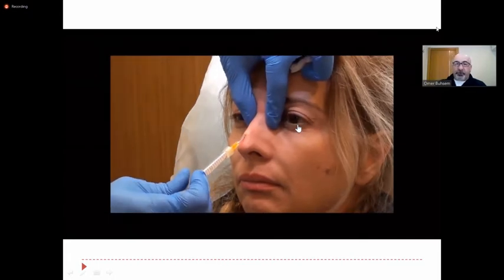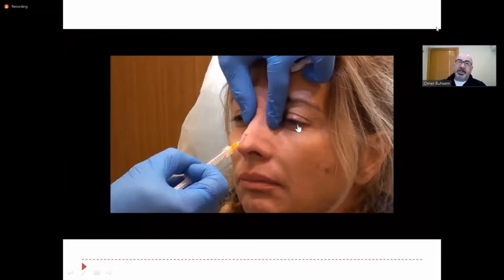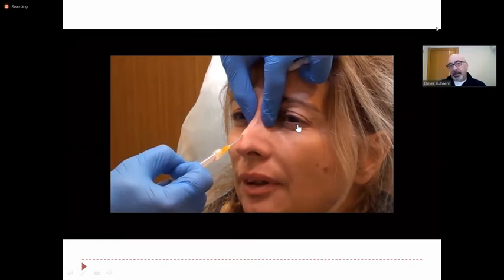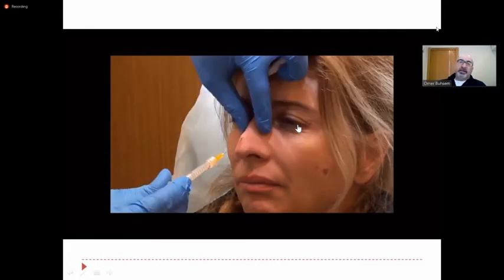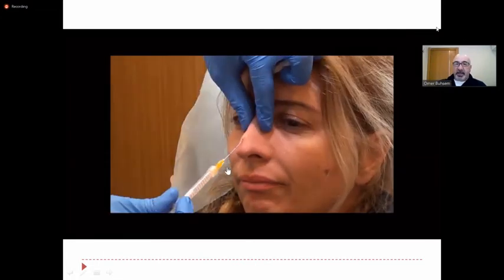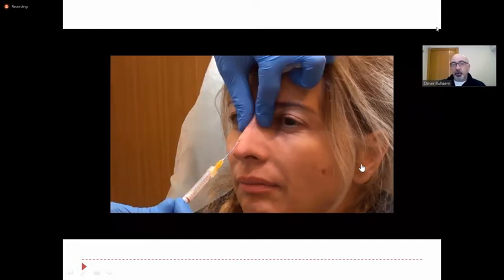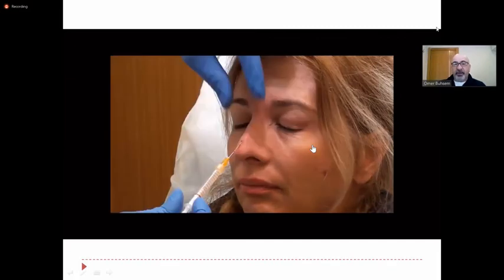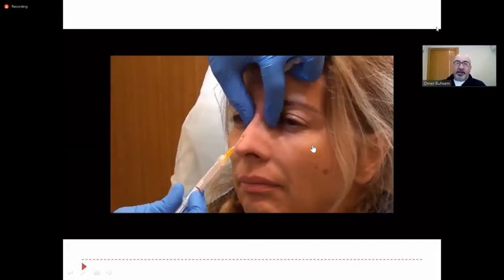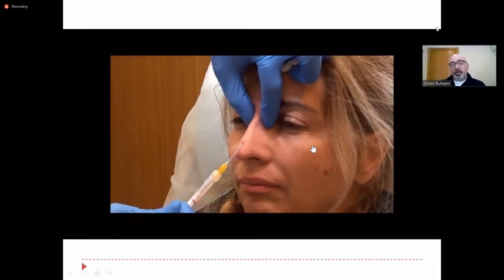After you finish to dissect the area and create a whole space for injection, you will aspirate and do a linear retrotracing injection on the dorsum. Okay, this is a really difficult case, and I want to show it. Why? Because we use here 1.5 agarose gel concentration. Normally in the nose we use 3.5 and 2.5, but this patient has very thin skin and a very complicated nose, so we prefer to use 1.5.